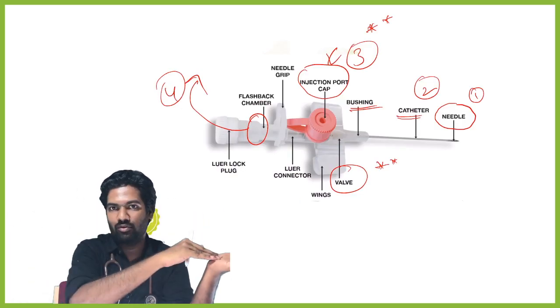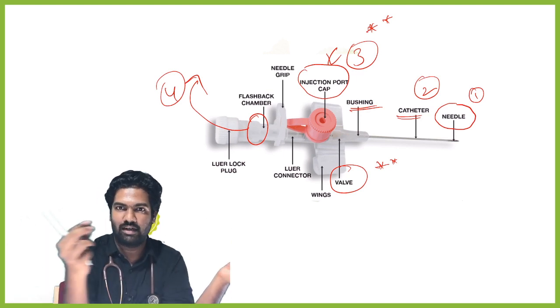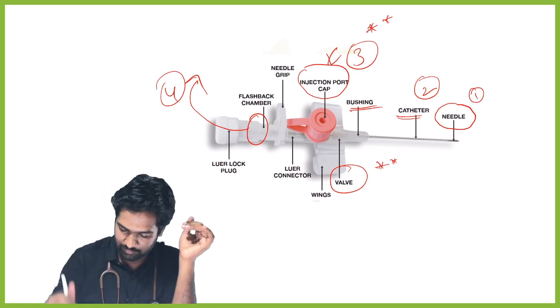The only thing is that it is again making it unidirectional. The blood from here we want to go to here, not that air might enter this side. The moment you remove this, it will start getting filled with the blood only, not that air will come inside it. Okay. Fine.